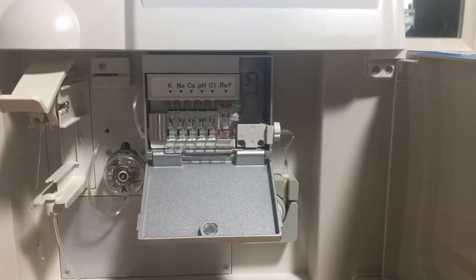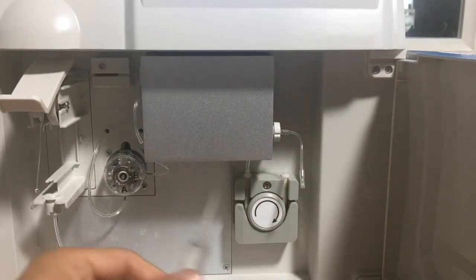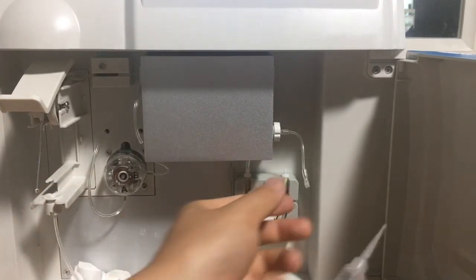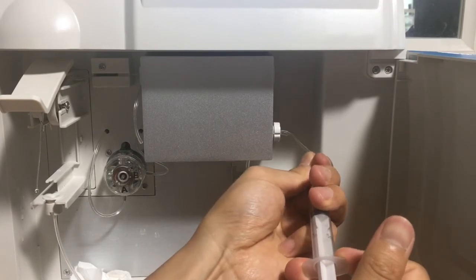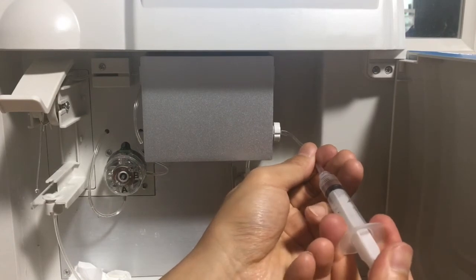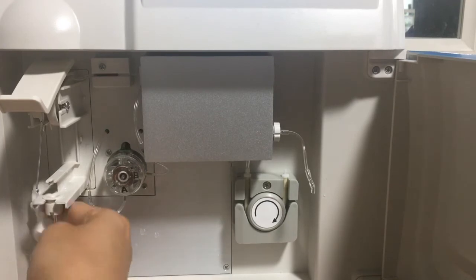Next, we remove the blockage from the electrodes — it's marked in red. First, we disconnect the cable, then we put some tissue here to collect the water. We inject water from here and we can see the water coming out from the left side. If there's water coming out, it means this part has no blockage.